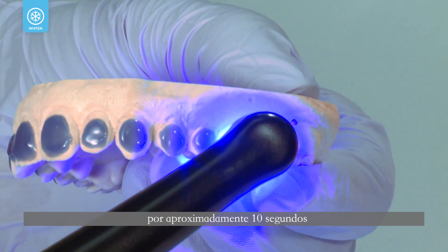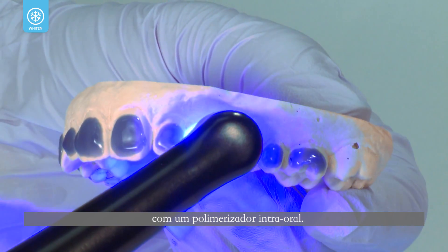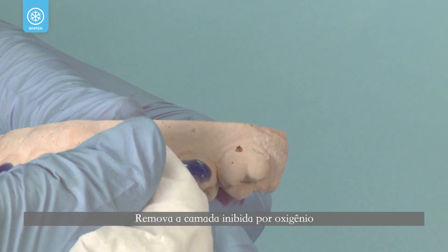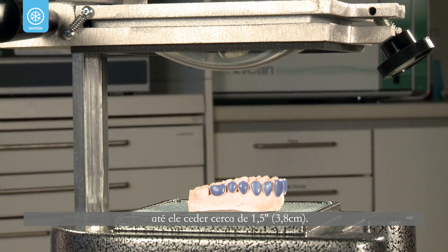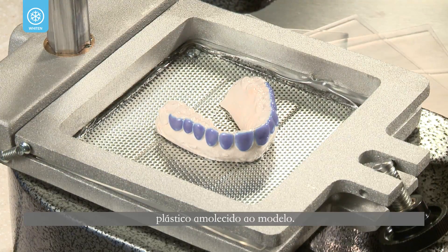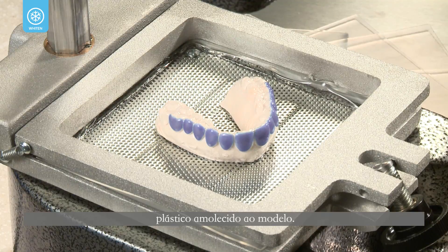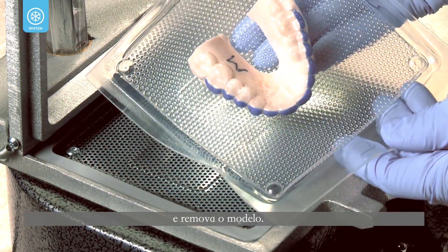Cure Ultradent LC block-out resin for approximately 10 seconds per tooth with a handheld intraoral light. Wipe off the oxygen-inhibited layer. With a vacuum former, heat the tray material until it sags approximately one and a half inches. Activate the vacuum and adapt the softened plastic onto the model. Allow the tray material to cool and remove the model.